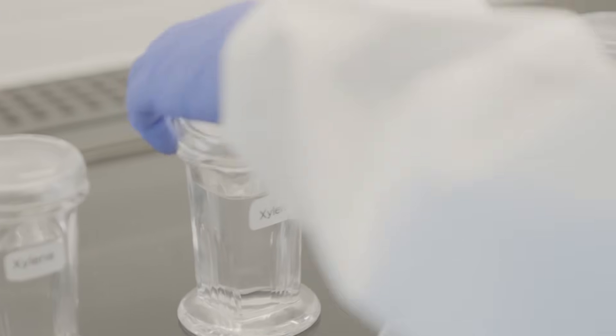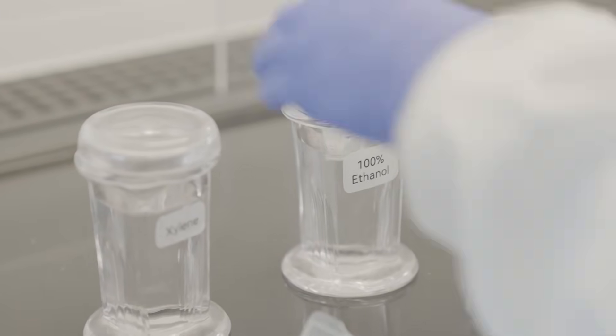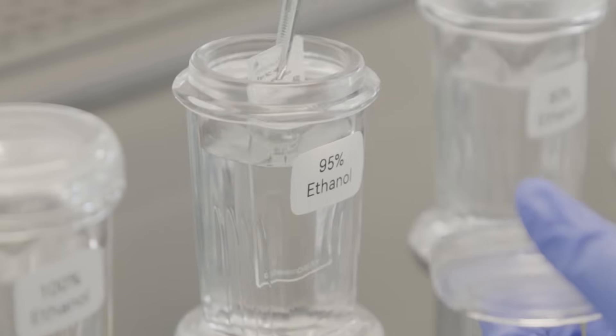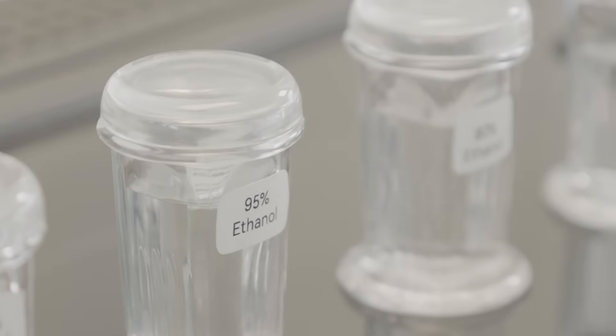Next, start rehydration by placing sections into a container of 100% ethanol for five minutes. Sequentially place the sections into containers of 95%, 80%, and 60% ethanol for five minutes each.